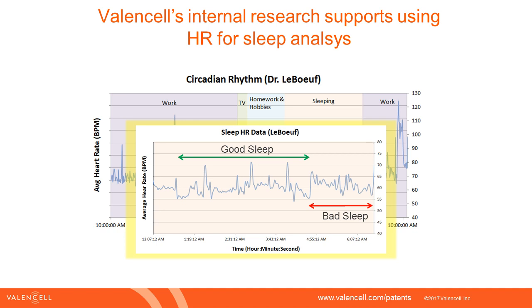What this exploded view shows is just my sleeping stage. What's interesting is you can see where I've had good and bad sleep. For example, my REM sleep is clearly identified by the 3 little peaks you see there, where I was going in and out of different stages from deep to REM sleep, where I was actually dreaming. And when I started to not sleep well, you see that pattern is lost.